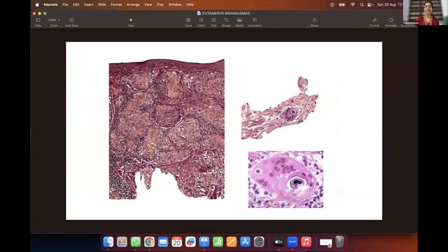In these granulomas, if you observe, you'll see that it is predominantly the epithelioid histiocytes and very few lymphocytes within the granuloma or in the periphery. Very few lymphocytes. That is why these granulomas are referred to as the naked granulomas. And within these granulomas, you will also observe something called the asteroid body, which I showed you earlier. The starburst-like appearance, eosinophilic inclusion, which is seen within the giant cell.